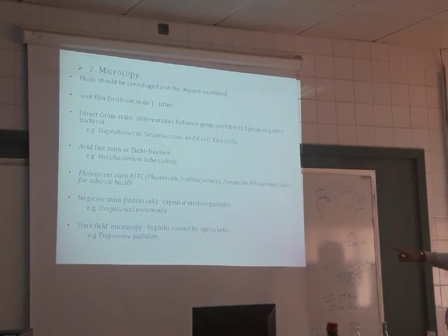One more is called dark field microscopy for syphilis, a disease caused by Treponema pallidum. You need just a dark field microscope. Simple. You put the microbe on the slide, you can check it, and you will find it very clear. Under the darkness, it looks white in color.